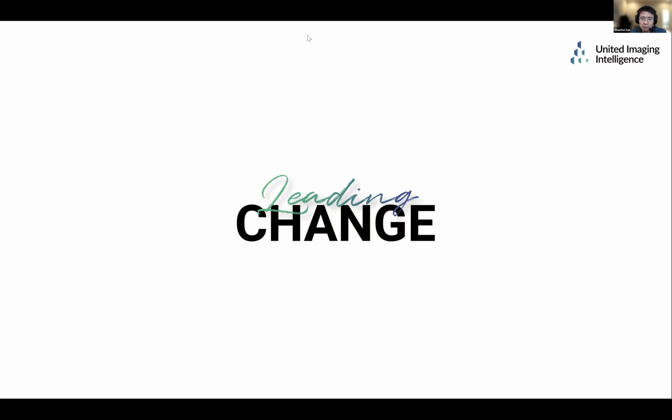We also use the inverse Fourier transform to generate the initial result. When we do the image recovery, we are working in the image domain. Acquisition is in the k-space domain, and recovery is in the image domain. That's why we utilize the inverse Fourier transform to initialize the neural network reconstruction procedure. Step by step, we update this image to add detail and remove the artifacts from the initial inverse Fourier transform result.